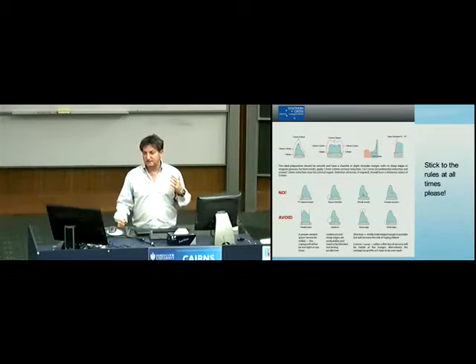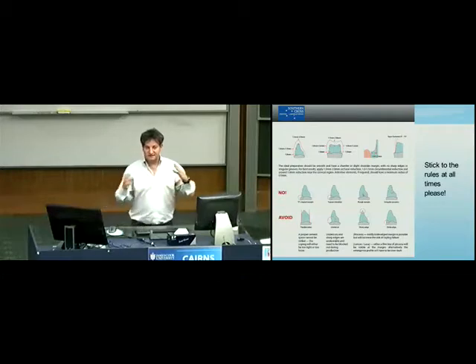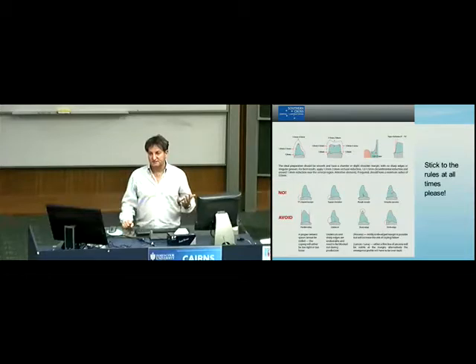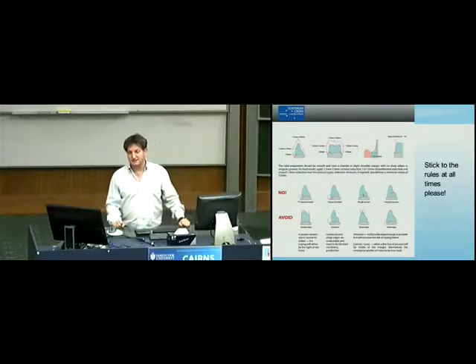All right, so we put them on articulators, and you sort of see we've got 3/4 of a millimetre space, and we need 1.5 to 2 millimetres. What do we do then? What do you think we should do? Would you prefer to get a phone call and sort of say, well, we haven't got enough room? Do you then say, well, do your best you can? Or do you sort of say, oh, it doesn't matter, I'll stick it in and what do I do?